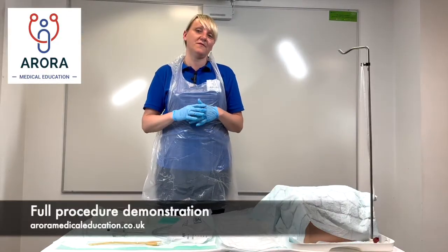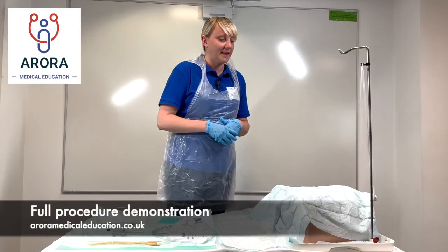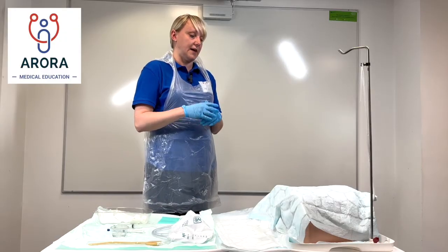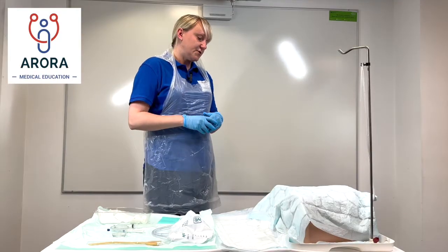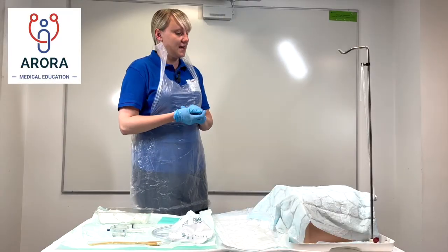Now we'll go through a full run-through of how to insert a female catheter. 'Hello Mrs X, my name is Dr Holway. I'm going to insert a catheter into your bladder if that's okay — it's a very thin tube which will pass into your bladder and collect the urine. I'm just going to check your details on your wristband. Can I check if you have any pain at the moment?'